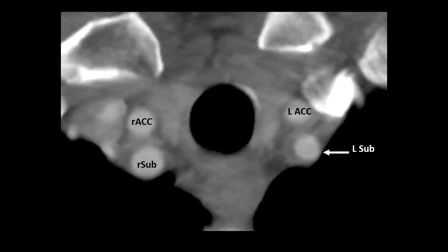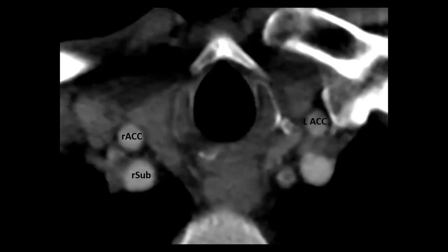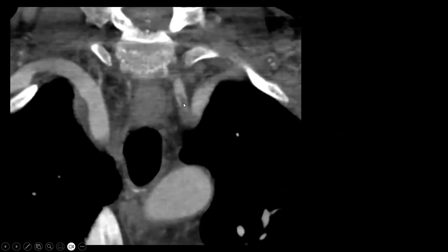What do we see on the rest of the CT angiographic study? This is the left subclavian artery, and we see that there is a soft plaque in the left subclavian artery. And this soft plaque, if you look at these coronal reconstructions, is quite extensive, and it extends all the way to the origin of the left vertebral artery. If we go back to axial images, this is the origin or the proximal part, the V1 part of the left vertebral artery. And this is the left subclavian over here, which is now free of thrombus. We see that this is a free-floating, unstable plaque, and probably part of it has flown into the basilar artery and caused an acute occlusion.